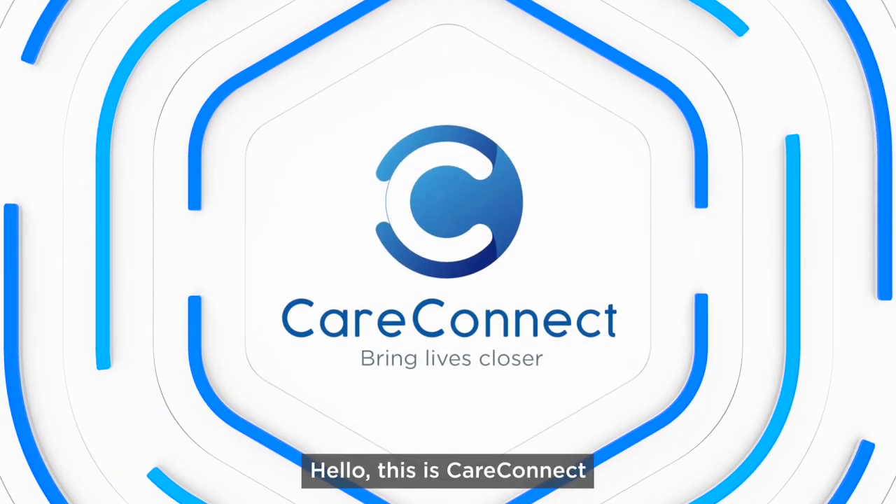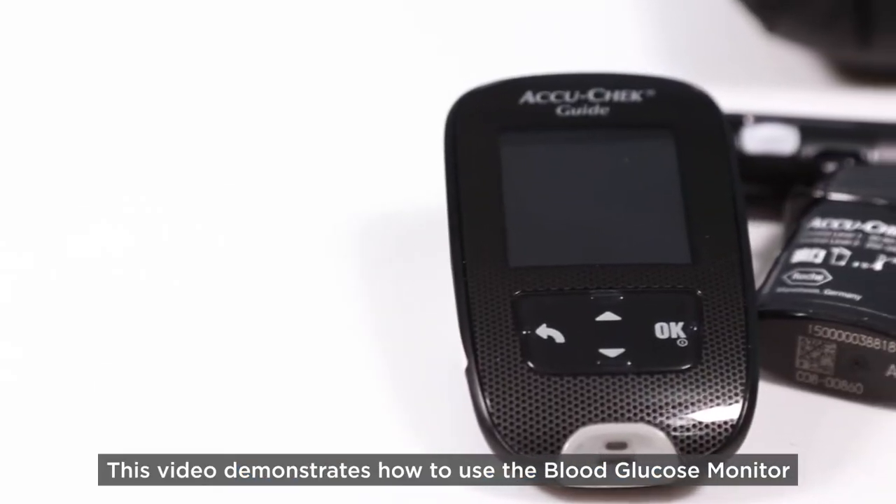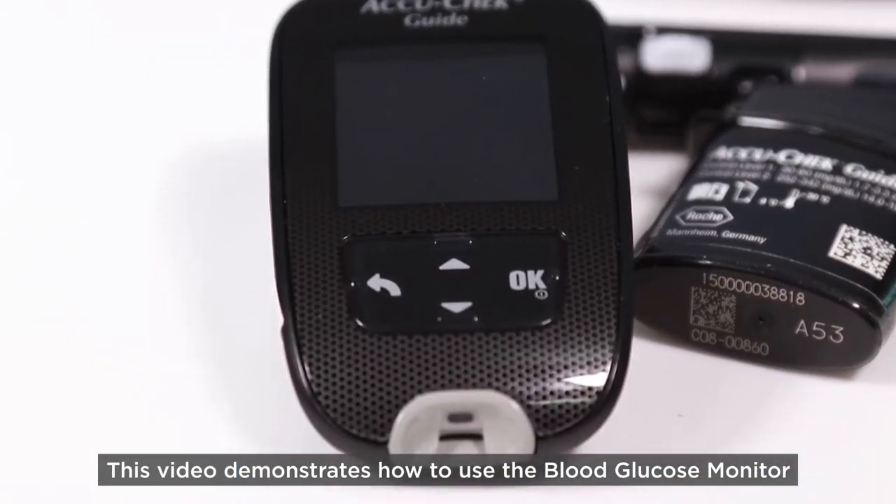Hello, this is CareConnect. This video demonstrates how to use the blood glucose monitor.